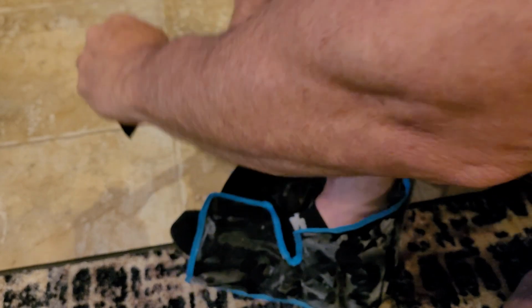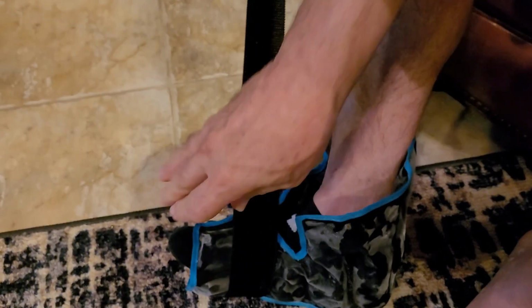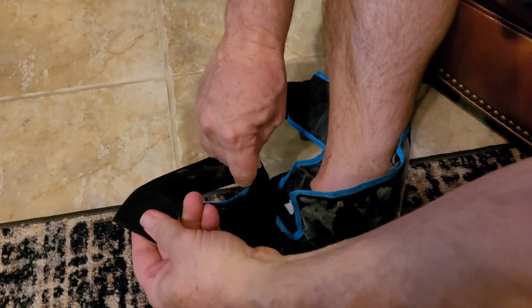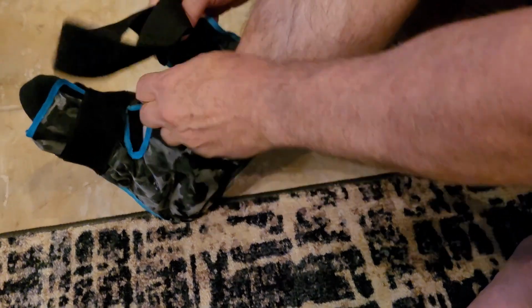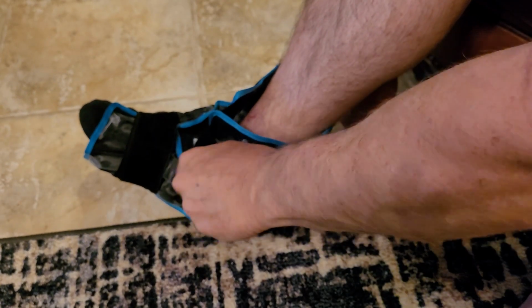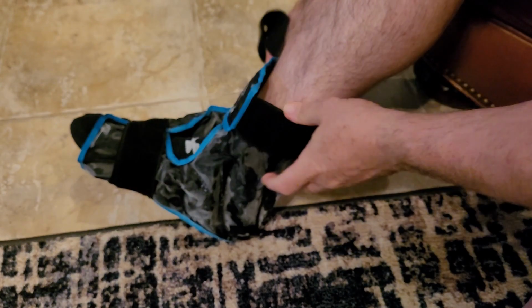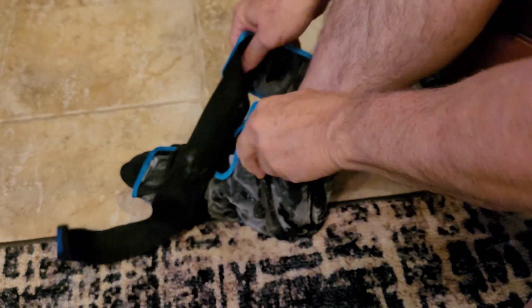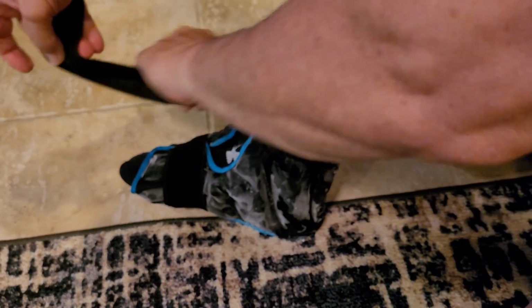I found, when I put it on, if I just hold this side here, come under, it goes around, and it has to go around twice. Otherwise, that Velcro gets stuck everywhere. Same thing here. Straighten it out. Hold it around. Wrap it around. Let's try that again. Okay.